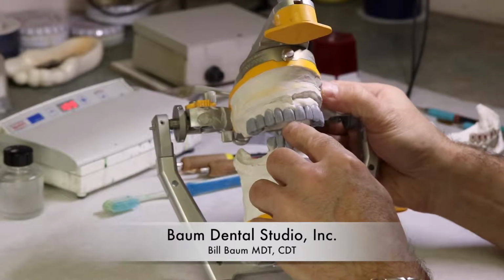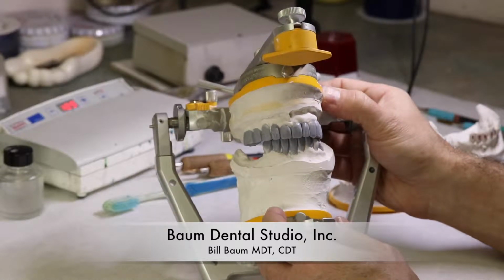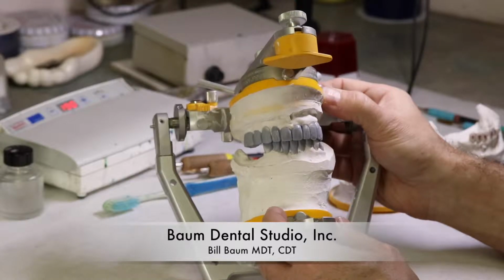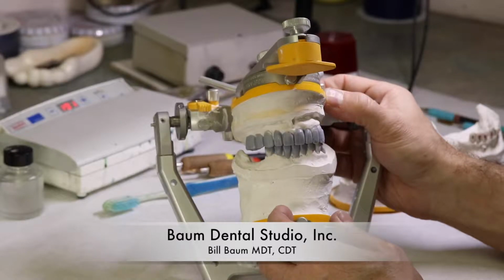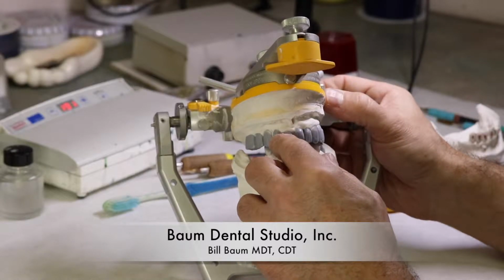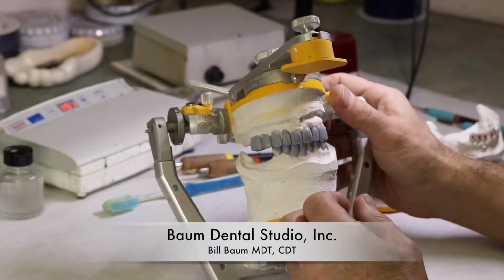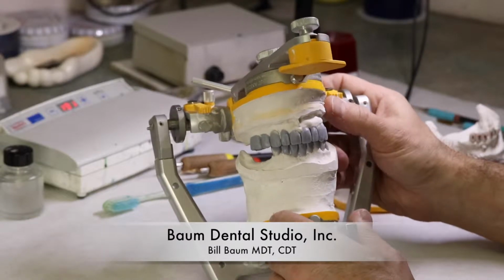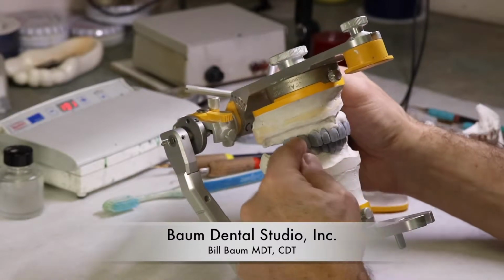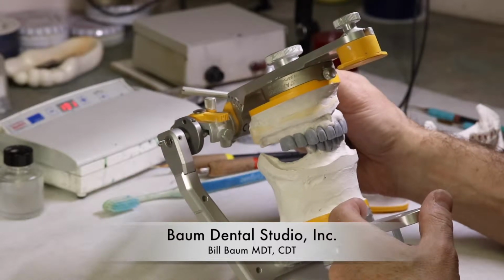This incisal edge of number 8 is approximately where the incisal edge was of the unprepared number 8. I did build it out slightly, and I'm hoping that that is good. I wanted to conform better with the dental arch, and it's not very much. It's about a 0.5 millimeter of wax on the labial surface, and as you can see, the occlusal plane is coming up about halfway up the retromolar pad.